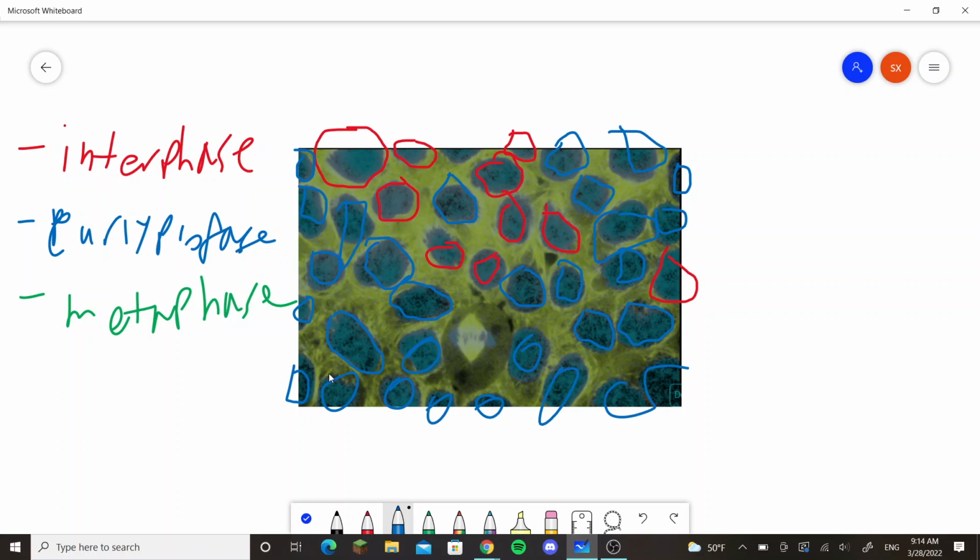And look at this one. Oh, that's a big one, right? So I've circled all these. We're going to be counting them all later.